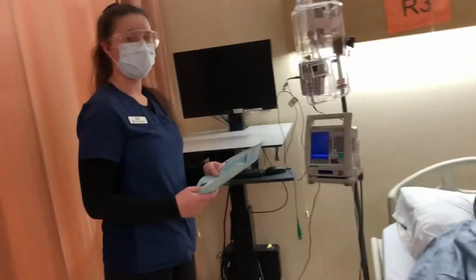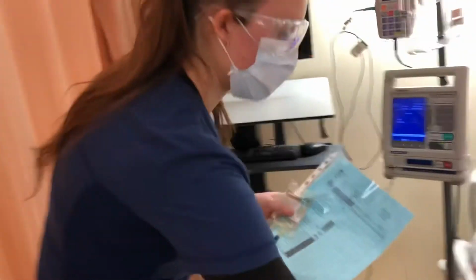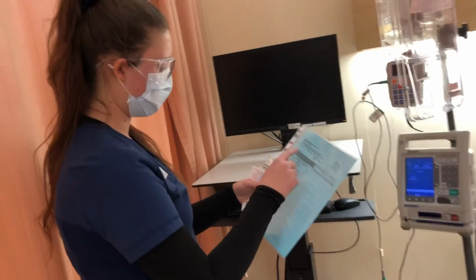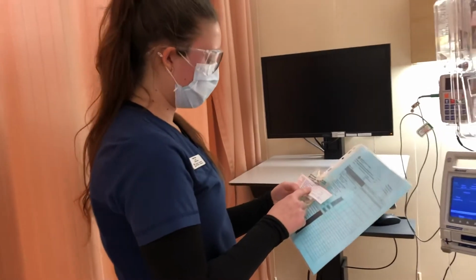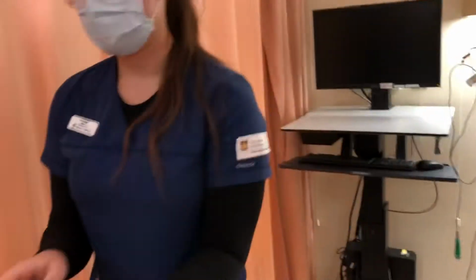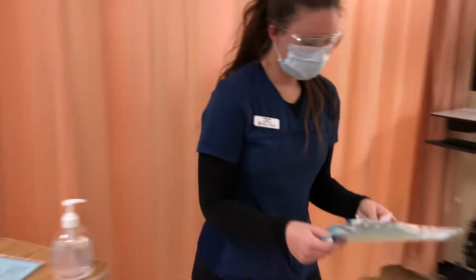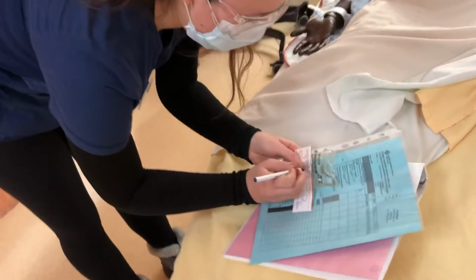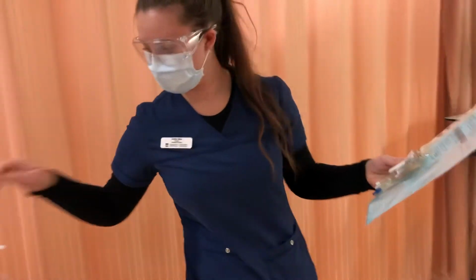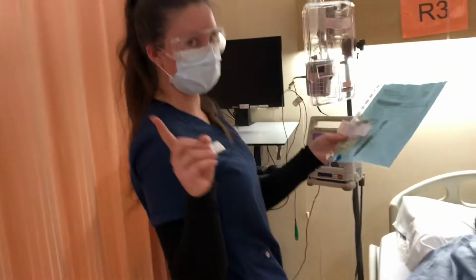So now I'm going to go ahead and do my third medication check. So this is Marcy Paris. This is for Marcy Paris. This is Morphine. Actually, I made a mistake on my med label here, so I'm just going to correct this. I got a pen, I didn't leave the room. The dose is not 50 milliliters, it's 50 milligrams. So that is my correction there. Yes, sorry about that, but I didn't leave the patient's room.